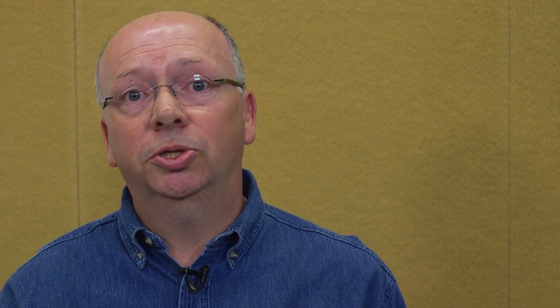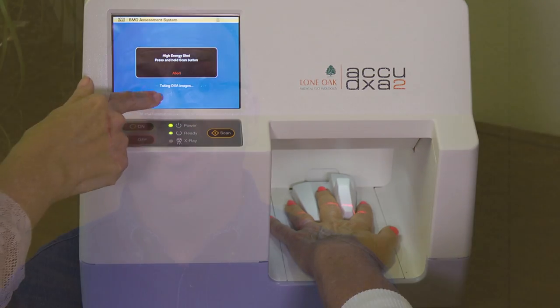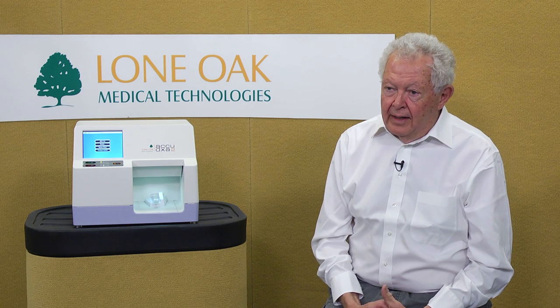Why do we measure the middle finger for bone mineral density testing? It turns out that the middle finger has similar bone composition to that of the hip, and it's a site with about 50 years of clinical acceptance. It is so much easier to position the hand and the middle finger than any other part of the body.